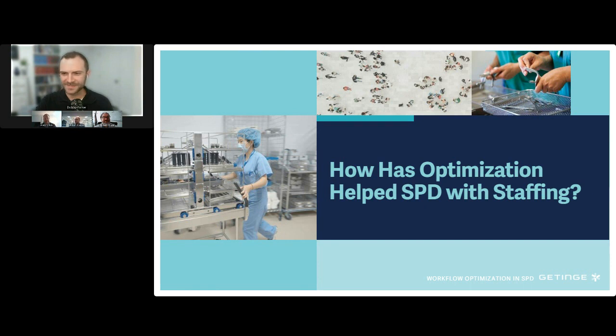It does, plain and simple, right? If you are not spending as much time with your instruments because you've optimized what's actually getting used in your trays, or to your point, Andy, if you're not pulling trays that are just traveling to the OR and then coming back sterile because they didn't need it, you are not going to have as much work in progress.